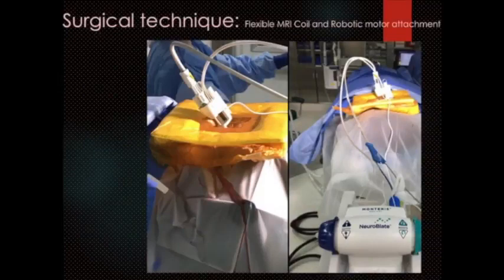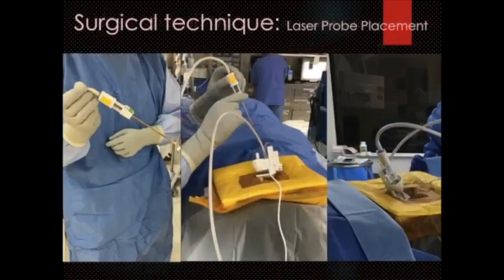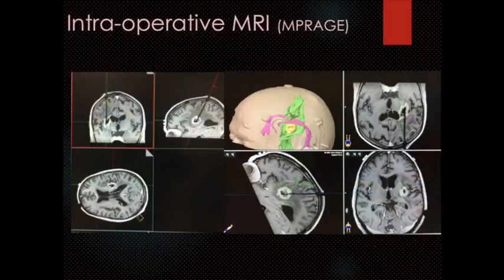The robotic Monteris arm is then attached to the skull bolt according to the manufacturer's directions. The length of insertion of the laser probe is then adjusted based on the stereotactic coordinate plan. It is then important to ensure that the laser fiber is functional by observing laser light upon laser activation before advancing the device into brain parenchyma and securing it in place. Once the laser probe is advanced, the patient is positioned in the intraoperative MRI scanner. A volumetric MP-RAGE scan is first performed to determine the exact location of the fiber within the brain parenchyma and in relation to the lesion.